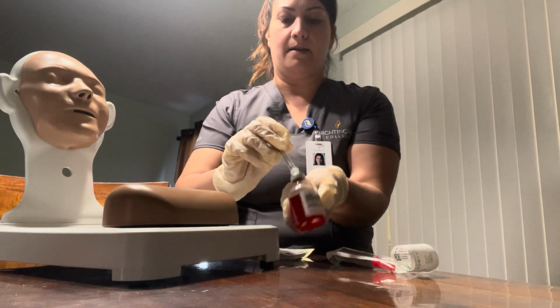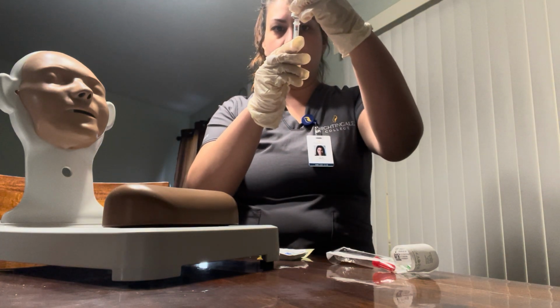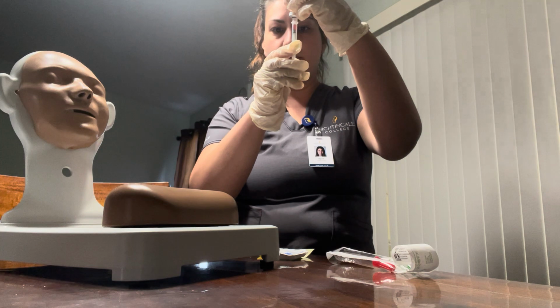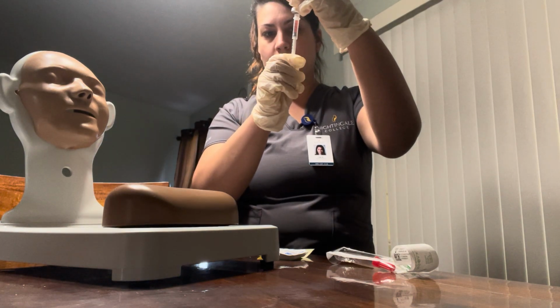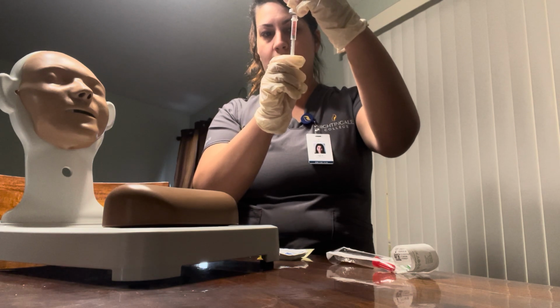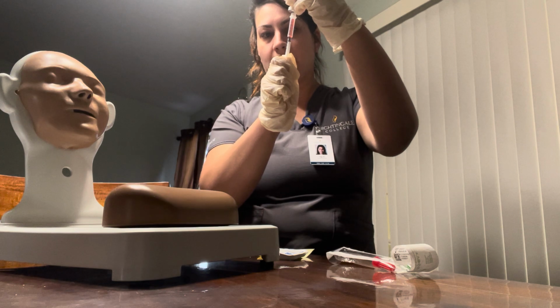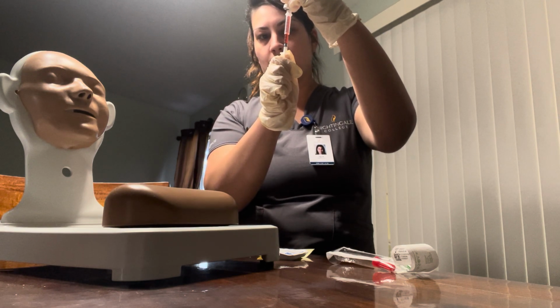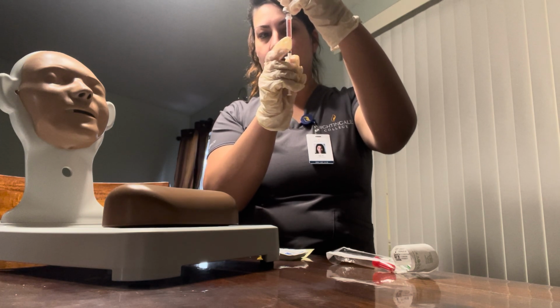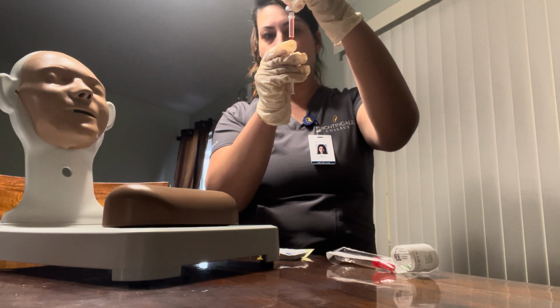I will flip it upside down and I will draw up 1 milliliter of medication. I'll make sure that there are no bubbles, which in this case we are good to go.